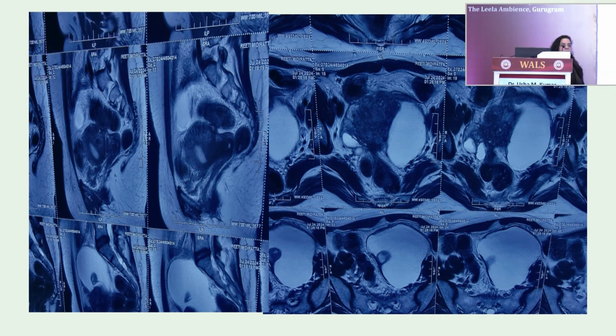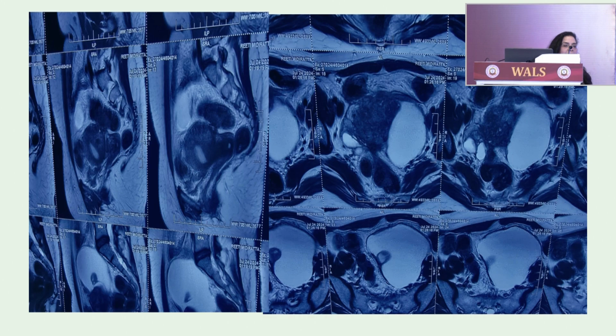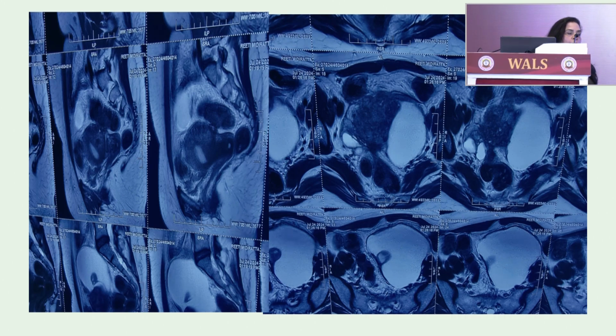If we talk about myomectomy, MRI is the GPS guide for doing robotic myomectomy or any myomectomy. We should know the exact number, site and size of the fibroid. Of course, besides the fibroids, we should rule out the possibility of adenomyosis and sarcoma. That is very, very important. And robo gives you the freedom. You can put these MRI films in the view box and sit down on the console, and you can view these pictures. Anytime when you do myomectomy and you are feeling lost, so that the last fibroid is not left behind, you can come to the view box and see the pictures.